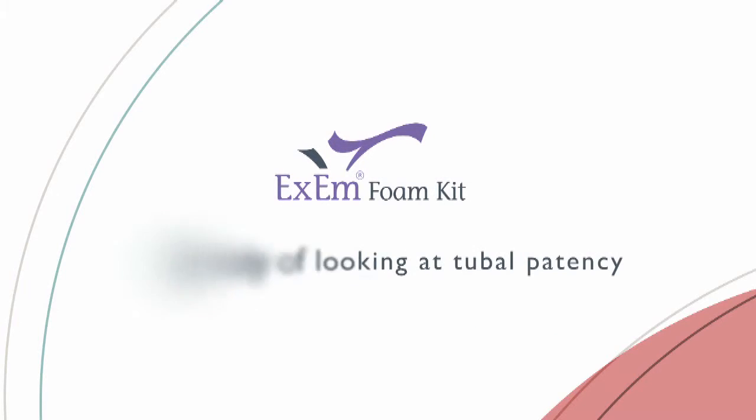EXEM FOAMKIT, tube of foam, a new way of assessing tubal patency.